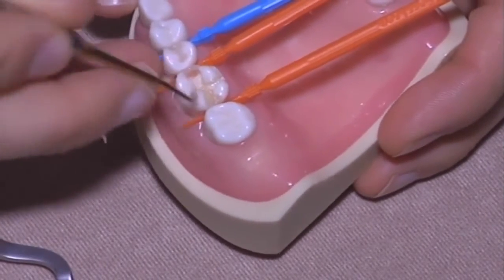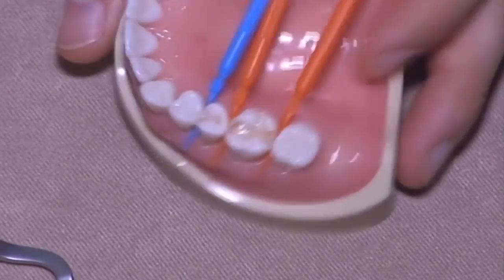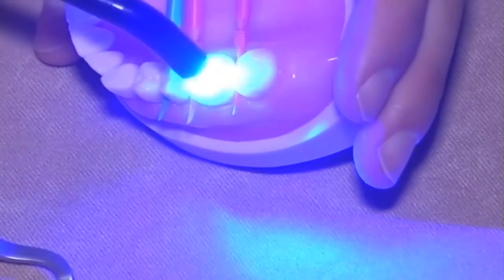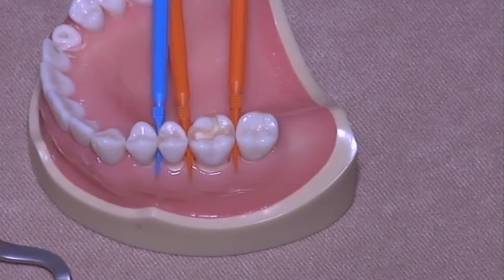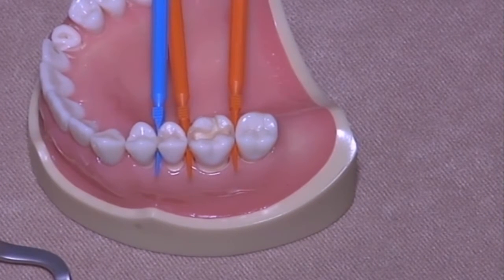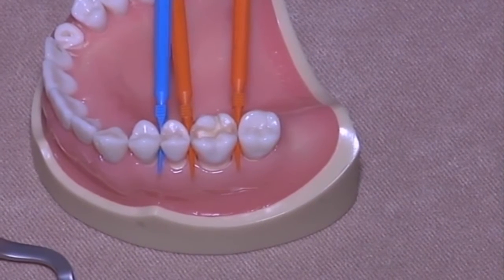Okay. And then light curing just to fix it. I think this patient is gonna bite anything this evening.